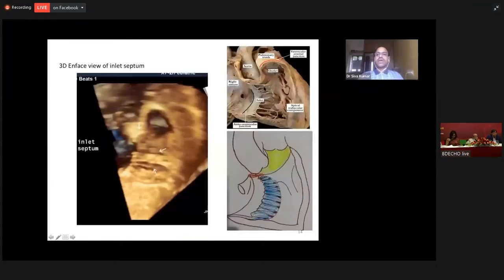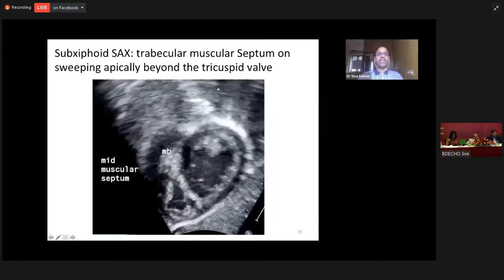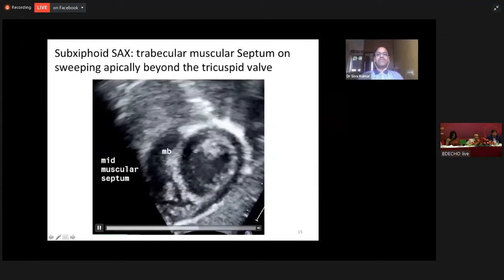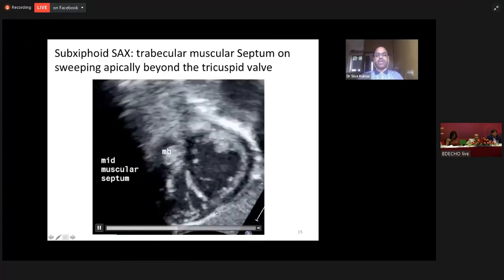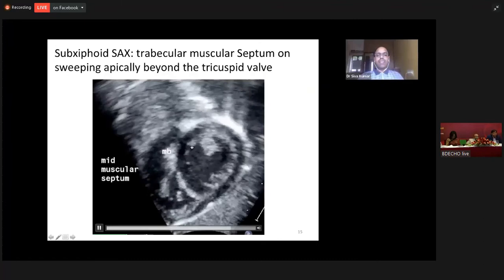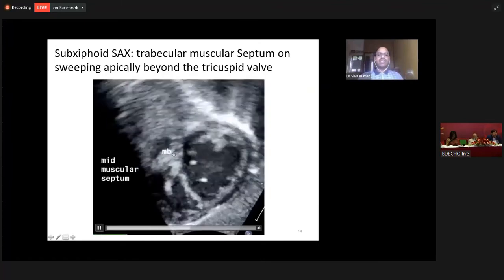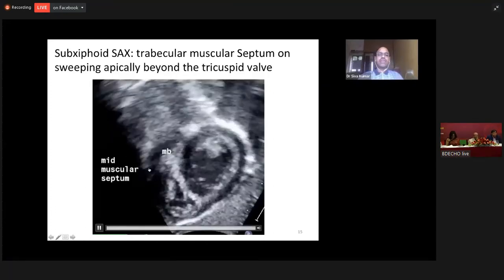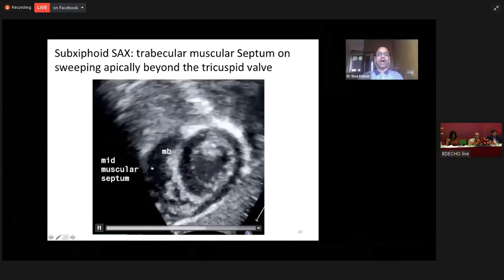This is shown on the cartoon and on the morphology specimen. In a subcostal short axis view, as you sweep towards the apex of the heart, the entire portion is the muscular septum. There is a round bridge of structure that is the septal band, which gives off an echogenic structure that goes to the right ventricular free wall — that is the moderator band. So the septal band and moderator band are features of the trabecular muscular septum.